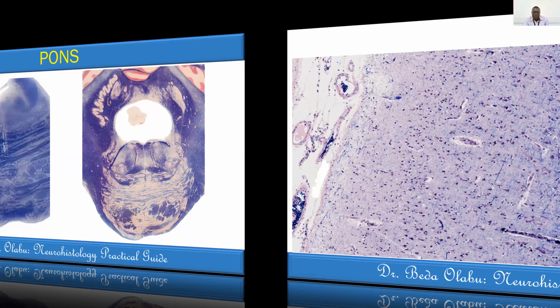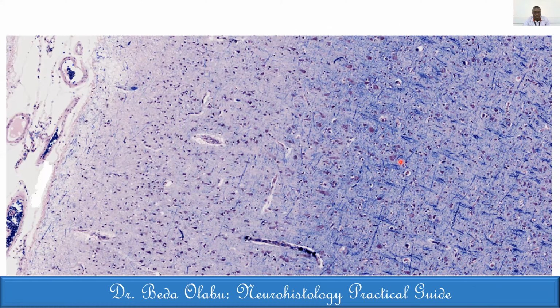Okay, I'll give you another slide. We will finish them, but you'll have to give me up to maybe another 20 more minutes, and you'll be done. So this is another slide. Any volunteer for this? Yes, Lisa?